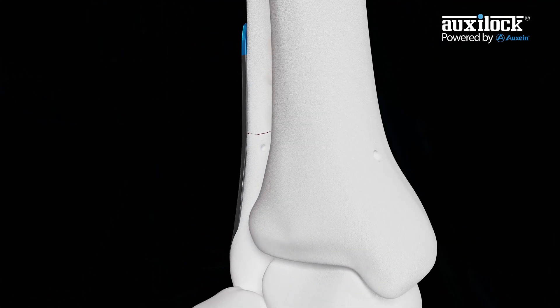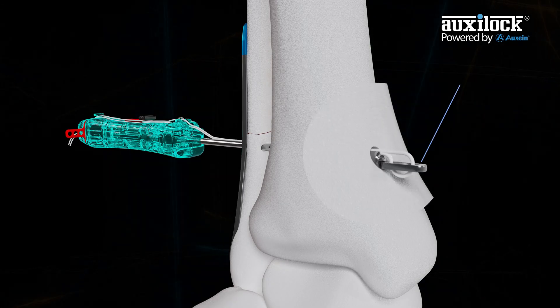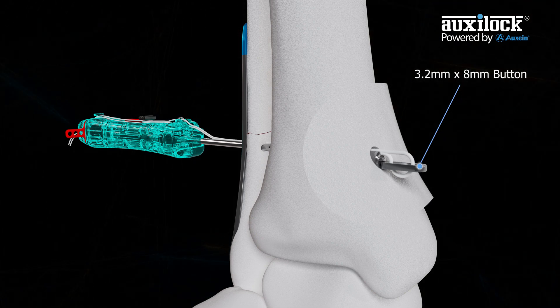Pass the Advanced Syndesmosis Ultimate Kit System through the fibula and tibia bone tunnel. Check under fluoroscopy to ensure the medial button exits the medial tibia cortex.